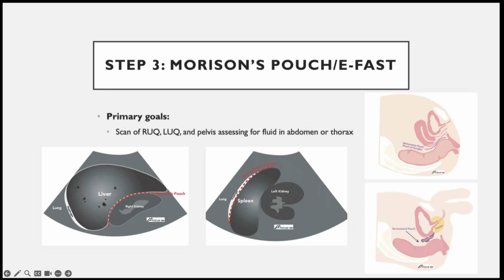These images are usually performed in the setting of trauma, but are very helpful in a non-traumatic patient on the medicine floor who is hypotensive. It can really provide some clues to diagnoses like ectopic pregnancy, if they have massive ascites, if they have spontaneous intra-abdominal bleeding, a retroperitoneal bleed, or intraperitoneal rupture of AAA.